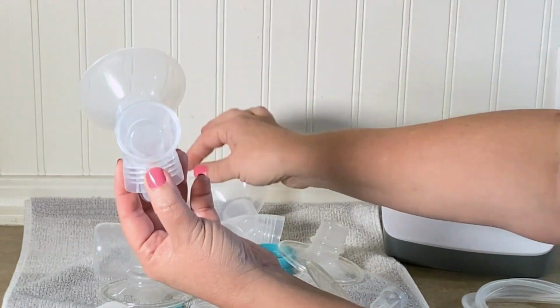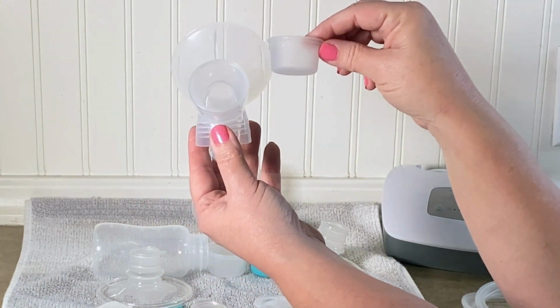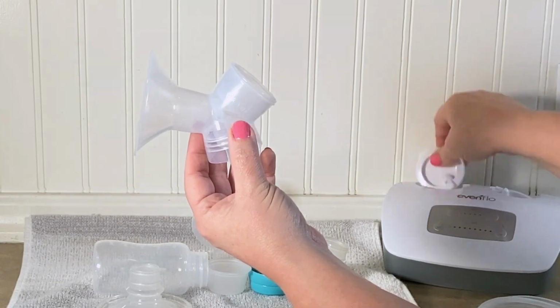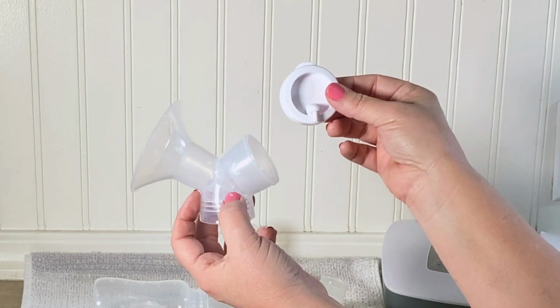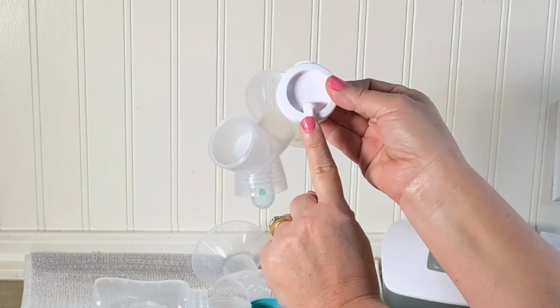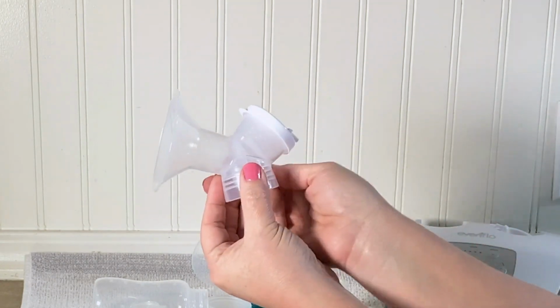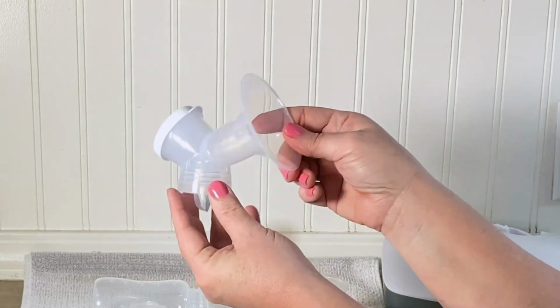Now we're going to turn our attention to the diaphragm. The diaphragm's the little opaque piece, looks like a little cup that goes in this part of your flange, so we'll set that in. And now we need the diaphragm cap. Now remember, we didn't wash this part because we don't ever want it to warp. So grab it from where your motor is and we'll put it on. I like to make sure that the little part where the tubing attaches is facing down. So I'm going to point that down now, and then I will just use my fingers and snap it on firmly.